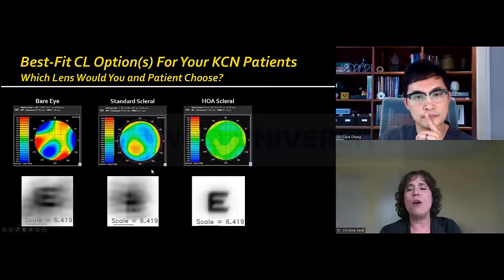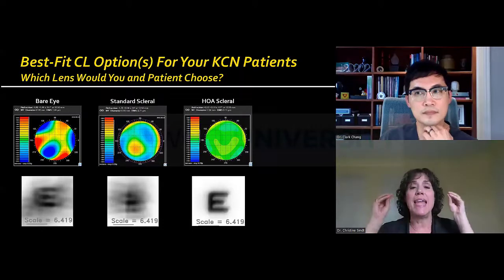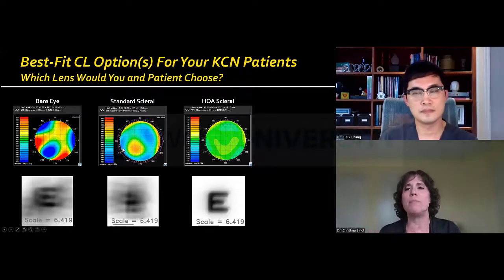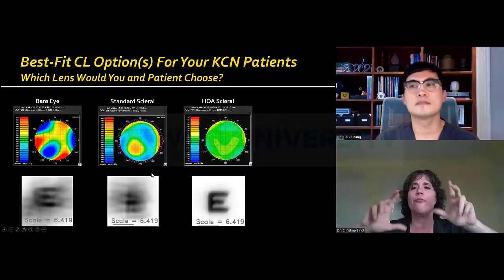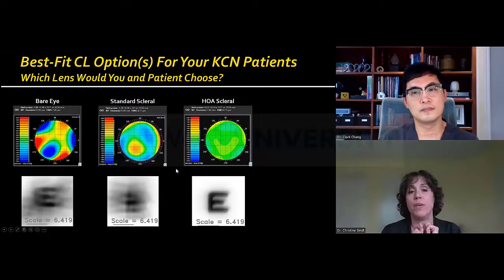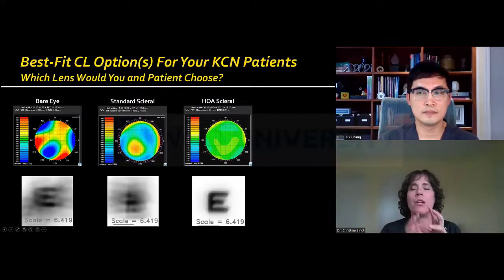And so he's now seeing, and this happens in every single keratoconic patient, every single one. By putting a scleral lens, by putting hard lens optics on, we reverse those aberrations. And some people are going to be way more symptomatic of it than others. And it's all going to come down to their pupil size. Okay, that's very important. So sometimes we don't actually make their aberrations better. We make their overall clarity better, but we do really weird things to their aberrations.